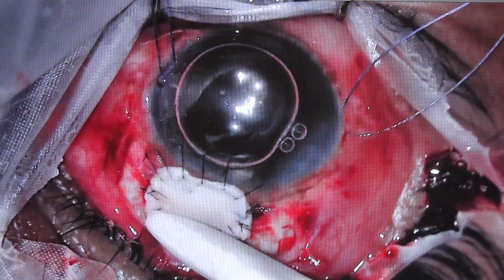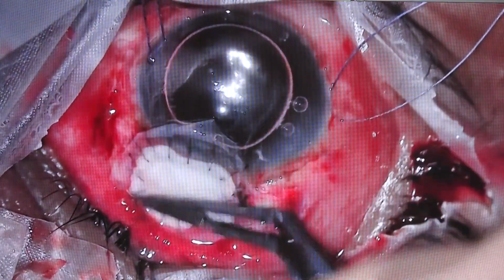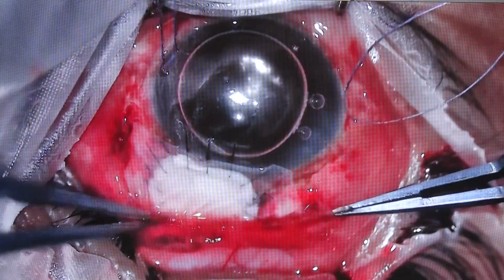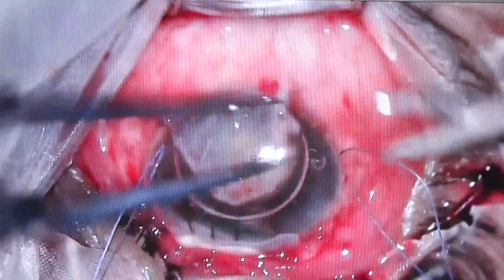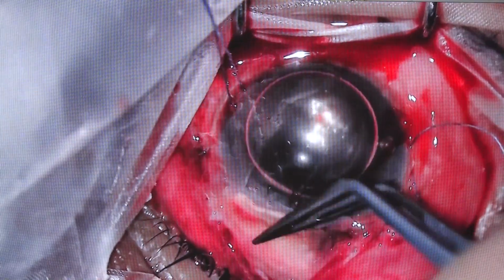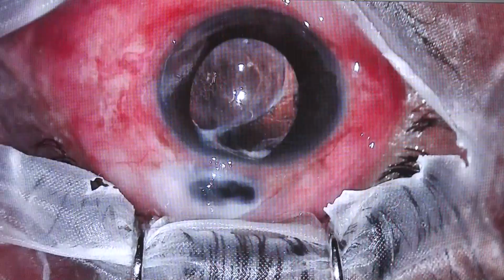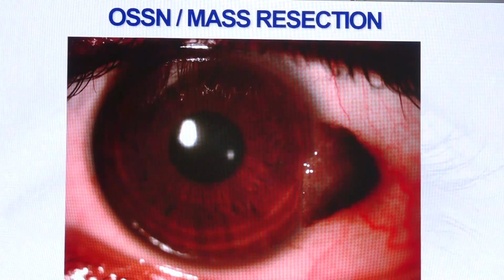And here, again, a hand-cut graft was used, covered by amniotic membrane. However, the rest of the conjunctiva I felt inadequate to cover the graft, so I just took a small inferior autograft. And the patient is maintaining 6/9 vision since then, awaiting suture removal.